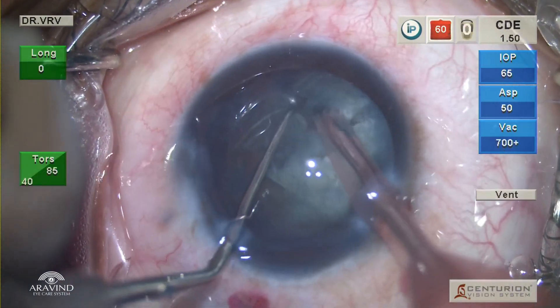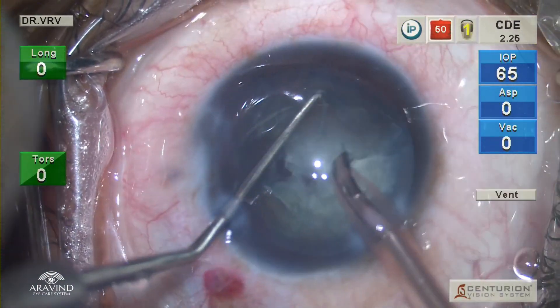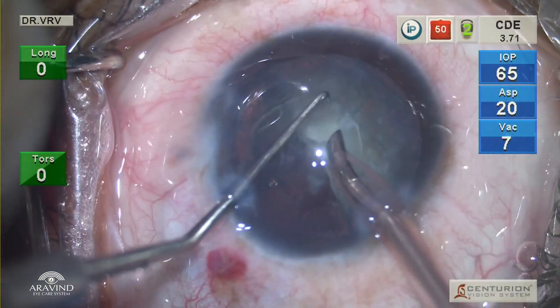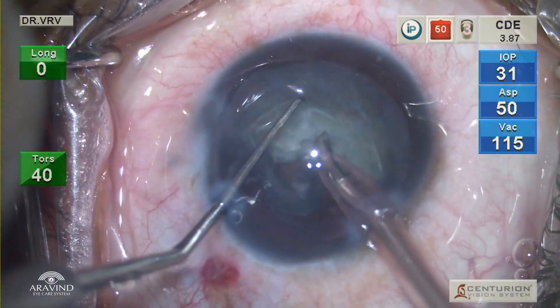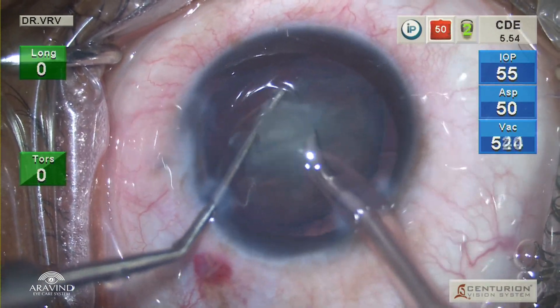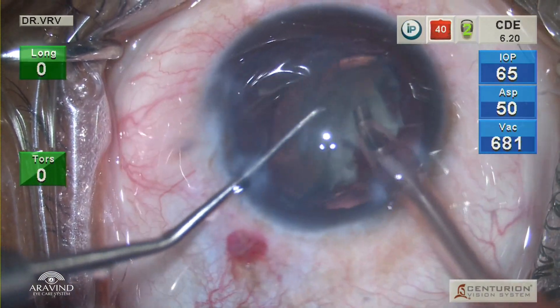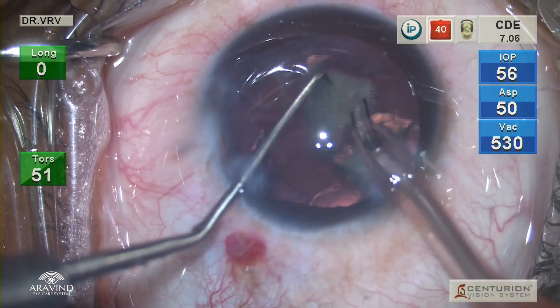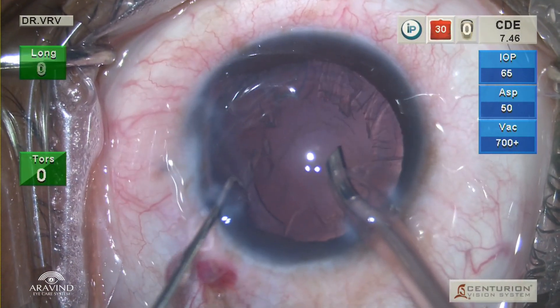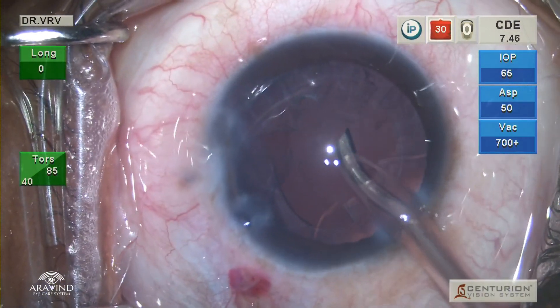The nucleus is chopped into multiple pieces and each piece is brought into the pupillary plane gently and emulsified. Care has to be taken while rotating the nuclear pieces within the bag, as aggressive maneuvering can cause worsening of zonular dehiscence and also lead to vitreous prolapse from the posterior segment. It is very important to maintain the anterior chamber during phacoemulsification, as any little surge can cause a posterior capsular tear. Once the nucleus is emulsified and the epinucleus is being removed, do not withdraw the phaco probe from the eye suddenly as this can lead to vitreous prolapse.